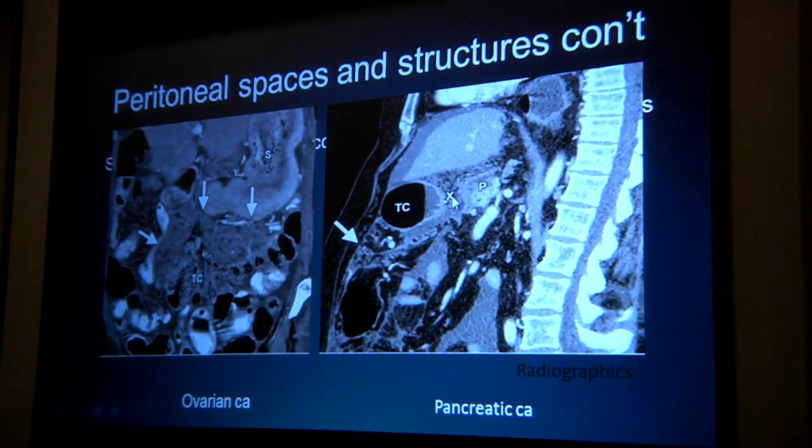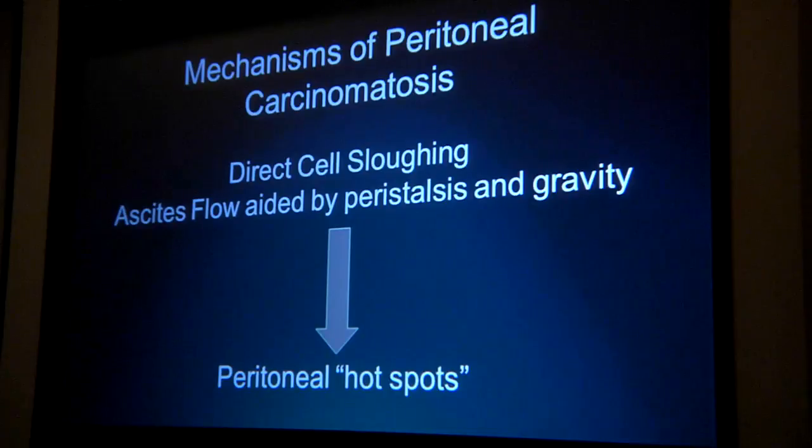And here you can see all of this tumor studding, both in the lesser sac and extending along the transverse mesocolon. We also incidentally see the greater omental fat here, which is full of disease. And then these low-density areas here represent ascites. So you can give the surgeon a precise area of the disease distribution, which is really what we try to do.